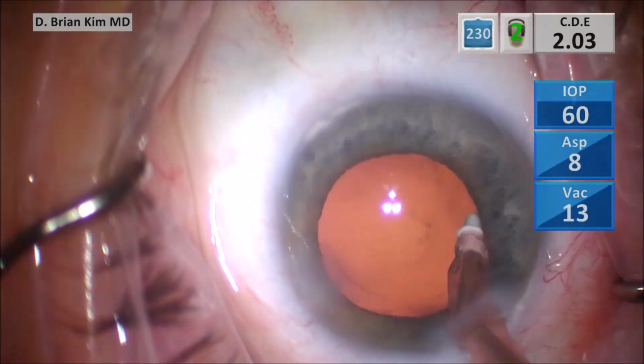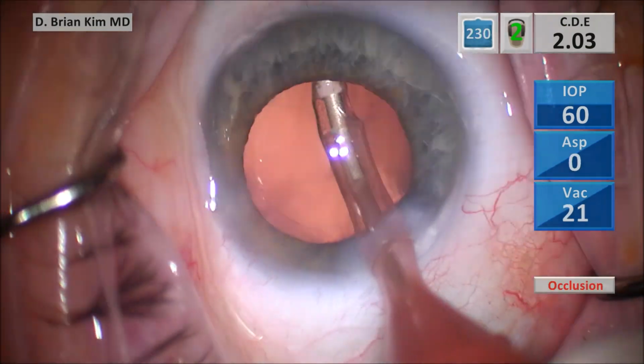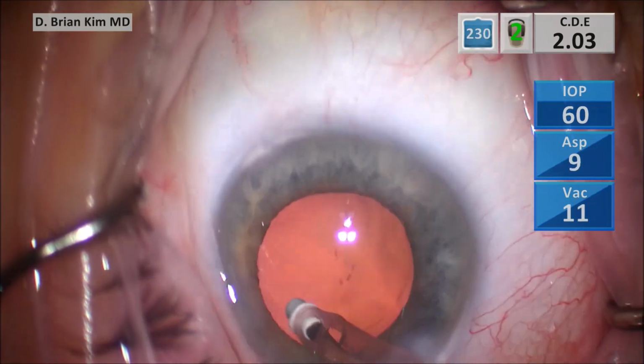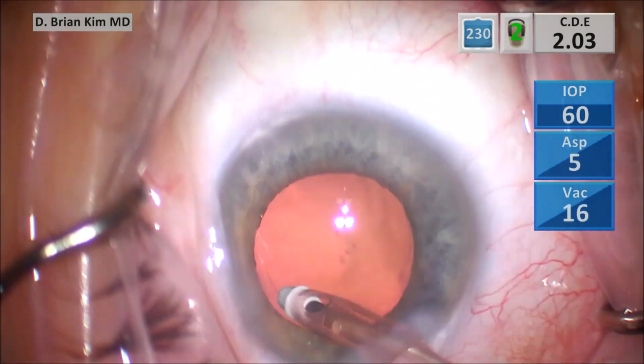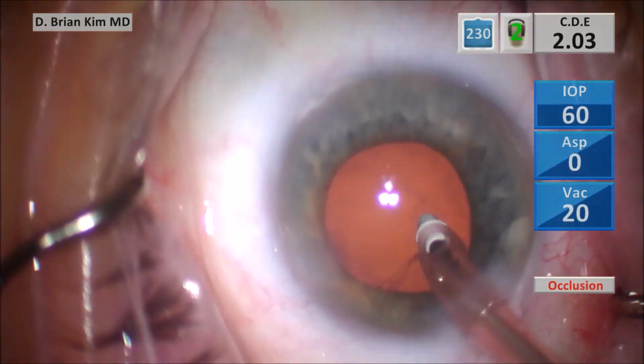So again, number 1, avoid aggressive hydrodissection, because if you're using aggressive hydrodissection that increases intracameral pressure, that means when the incision gapes, all the fluid and viscoelastic is going to come right out, and if the iris is floppy, it's going to come out too. So be very careful with aggressive hydrodissection.